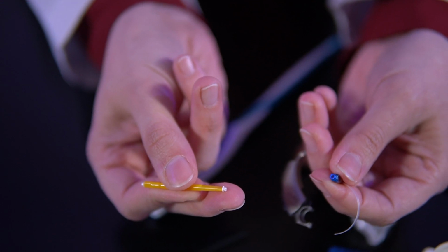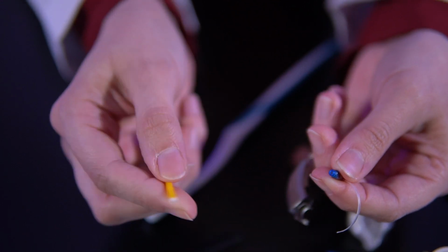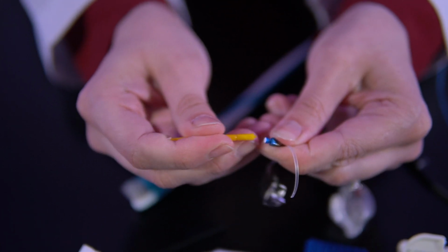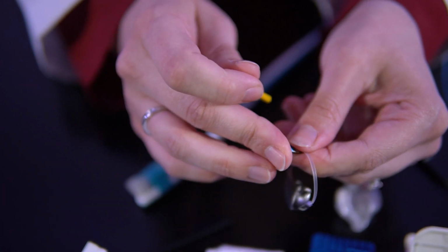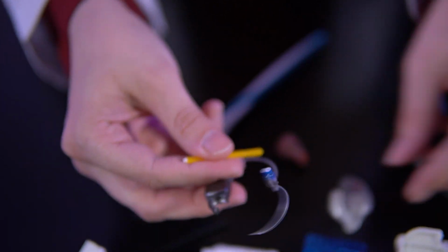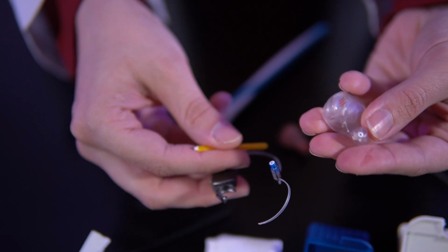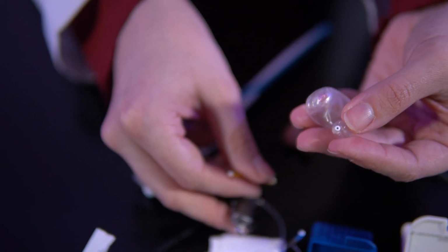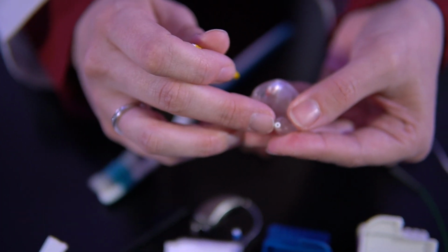So then we're gonna take our clean end, flip it around, and push it right back in there, okay? And I like to push it down just to make sure that it's in there well. The same will be on this one as well. You're gonna use your stick, take it out, push it just in here just a little bit.